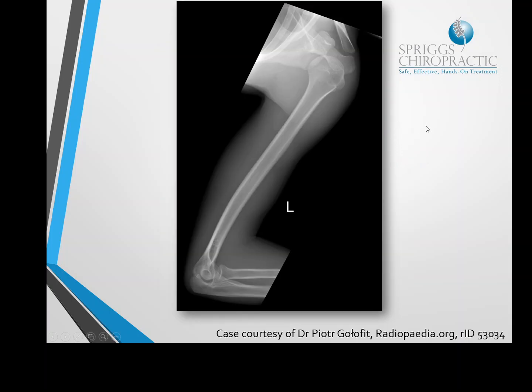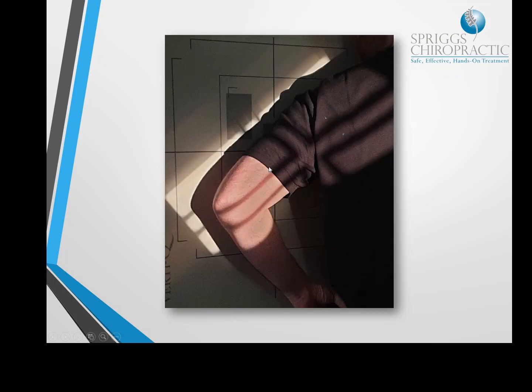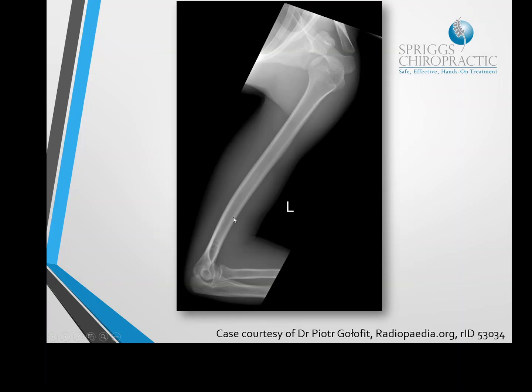So this is what it should look like. Just to point it out for you as well. So the more acutely aware clinicians and obviously students out there, the image that I showed you, the patient here, which is obviously me, has got flexion of the elbow, but it's moving away from the chest. So this is actually an externally rotated shoulder just here. So these are two ways you can do it. If the patient is capable of externally rotating the shoulder and bending the arm, then of course you can do this with them. That's not a problem at all.